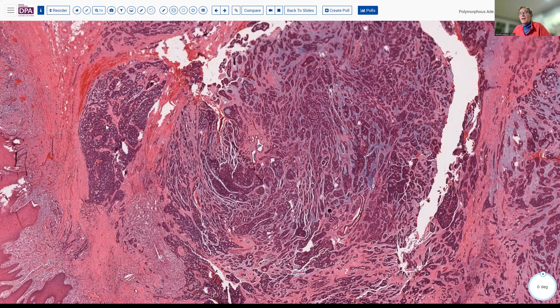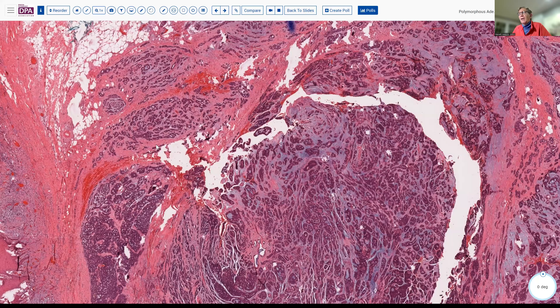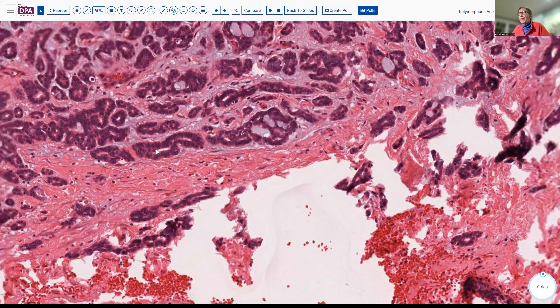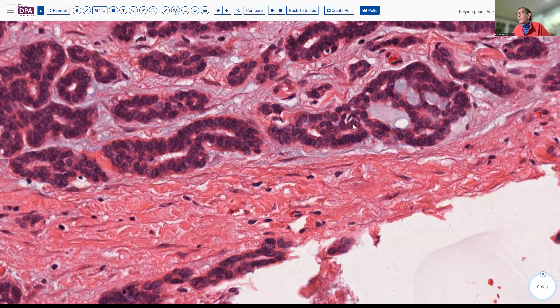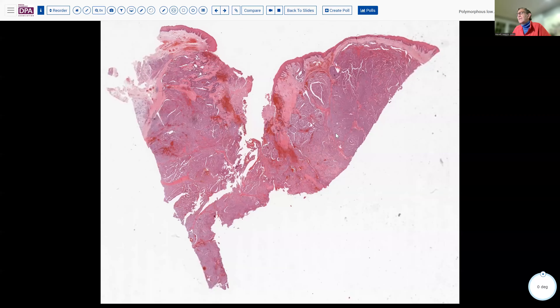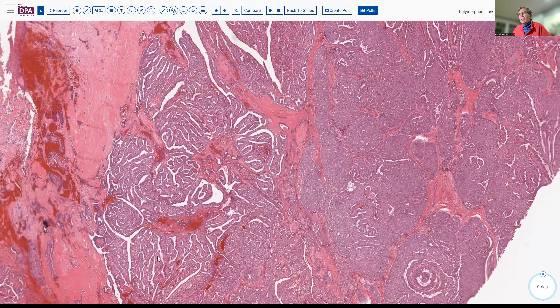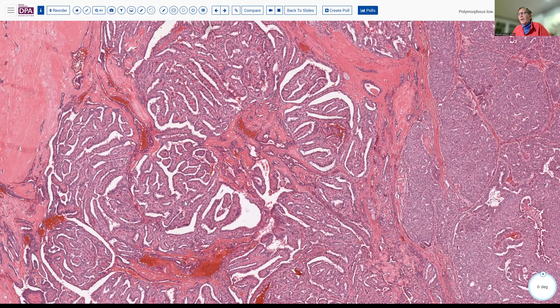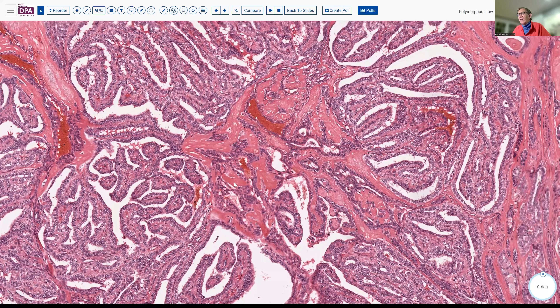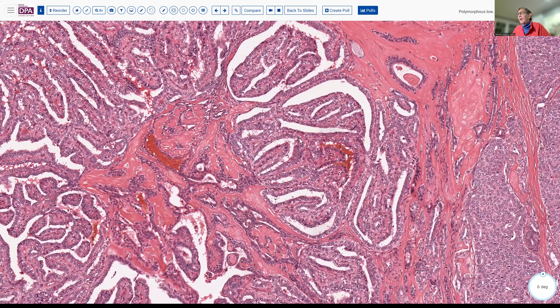Here's another one in the hard palate — squamous mucosa, and here's some minor salivary gland tissue. Then we have this tumor with an infiltrative pattern of small glands and small nests, a little bit of lace-like or cribriform pattern, and mucoid background. If there's probably any pattern that's kind of typical, it's more like this than those solid ones. But it is called polymorphous because it's quite variable. Looking at the nuclei again: notice how small, round, with occasional small nucleoli, scant cytoplasm, very small nests of tumor cells. And here's one more with an interesting papillary pattern — sort of branching glands and cords with papillae and a little bit of hyalinization of the stroma. All part of the spectrum of this low-grade polymorphous carcinoma.